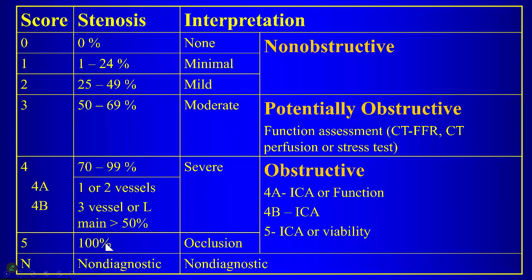And if you have complete occlusion of a vessel, that's a grade 5. The recommendation there is invasive coronary angiography or a viability study, to see, if you have complete occlusion of a vessel, how much viable myocardium is supplied by that vessel. Because if it turns out that the patient has already had a significant infarct and there is not enough viable myocardium supplied by that vessel, then revascularization of the vessel may not be helpful for that particular patient.